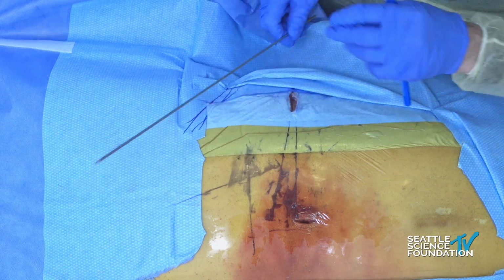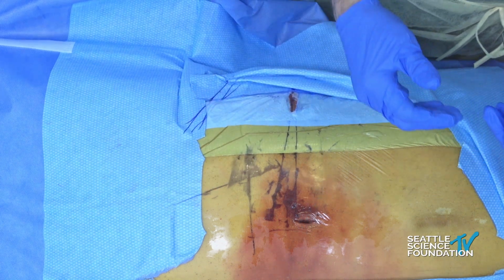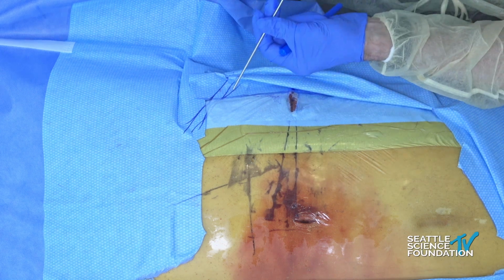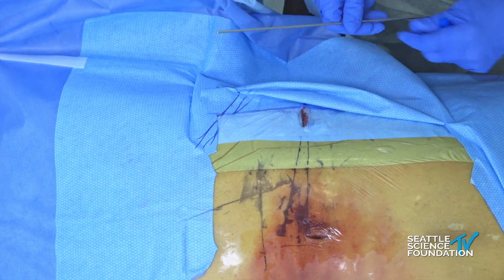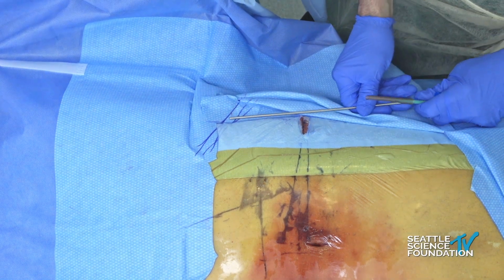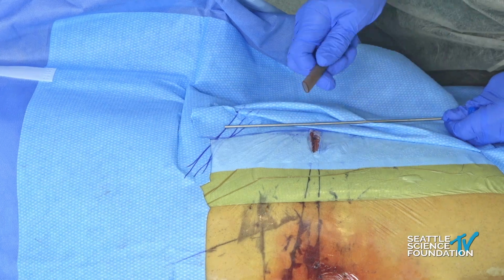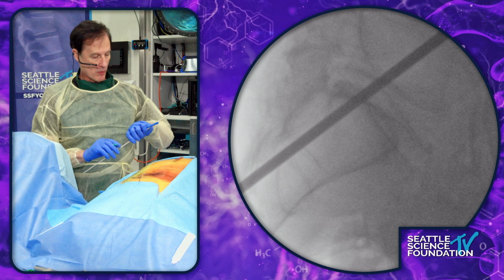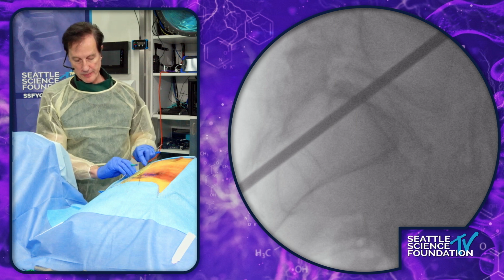So therefore I put marks on here to be able to find exactly where we are. Can you move toward me and give me a little bit of room here? And so we will start out by putting an implant in S1. So, picture this.